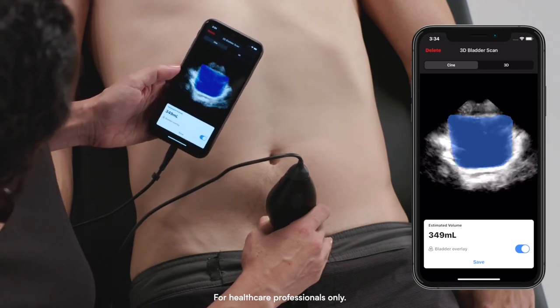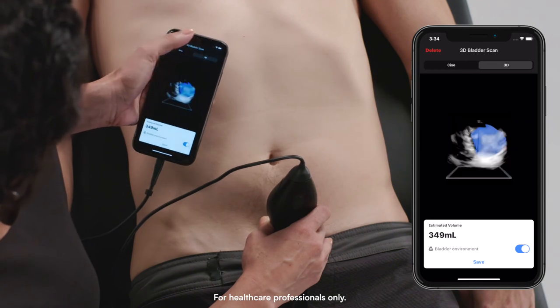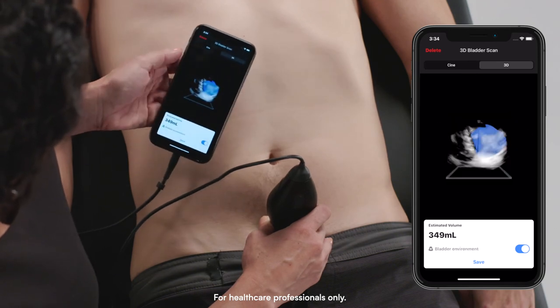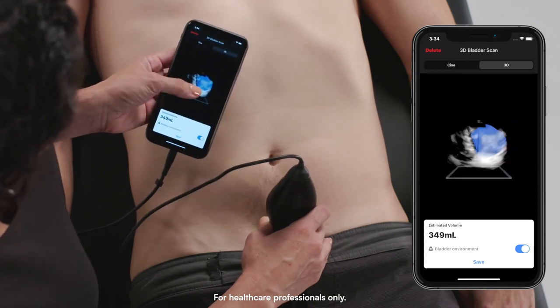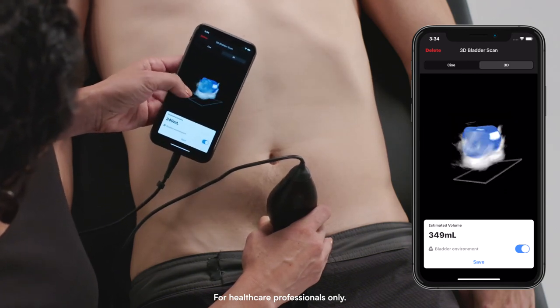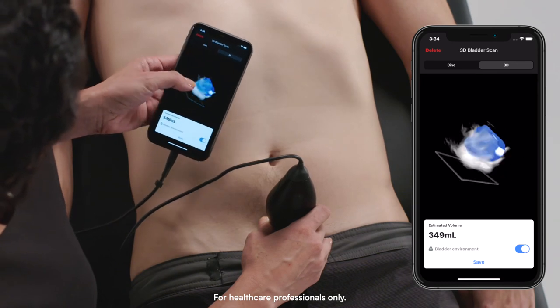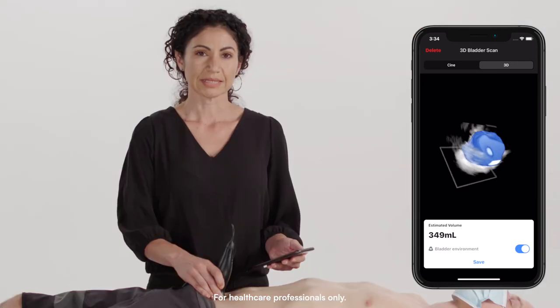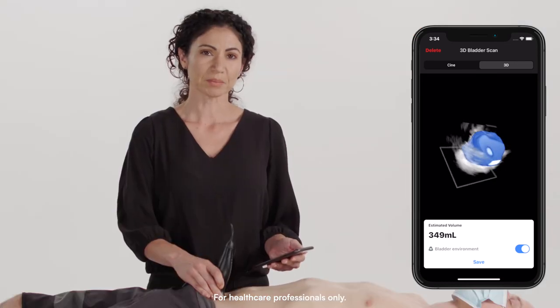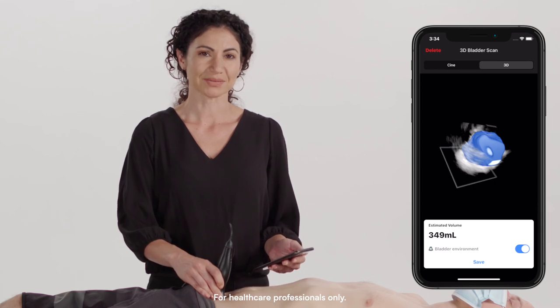If I wanted to review the bladder in three dimensions, I can tap on the 3D tab, and you can see the 3D rendered bladder. And that's how to perform a bladder scan with the Butterfly IQ+.